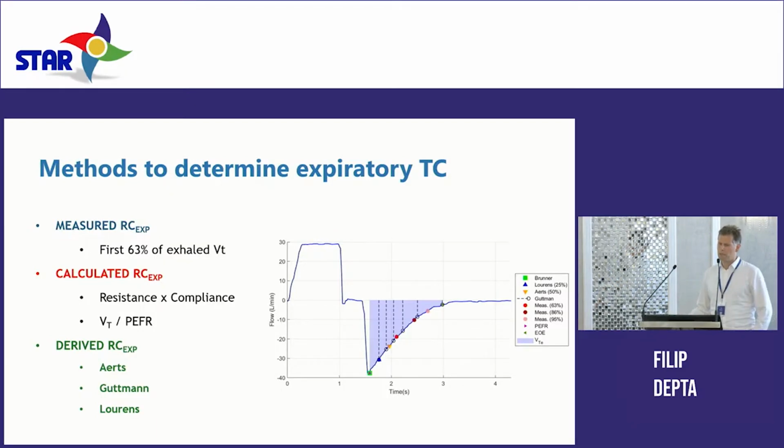How can we obtain it? So, as a means of lung emptying, there are different ventilators providing different means of determining time constants. Most common method is multiplication, so resistance times compliance. For that, you need hold maneuvers. So you have to arrest the ventilation at the end inspiration and end expiration. For example, Maquet Servo-U, Servo-I ventilators do that, and they will not provide values for time constant unless you do the hold maneuvers.